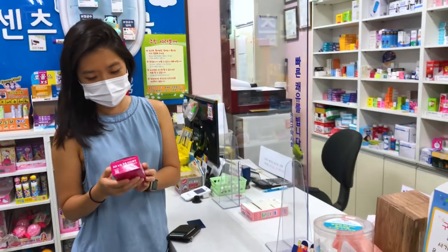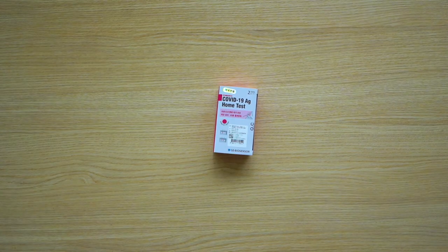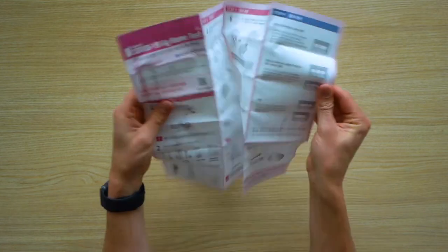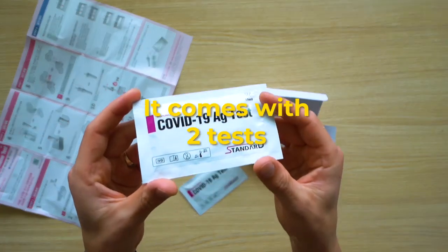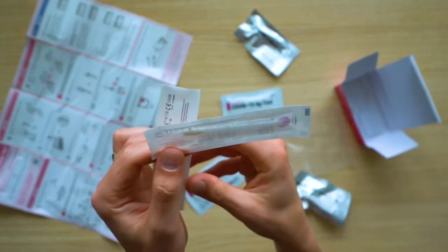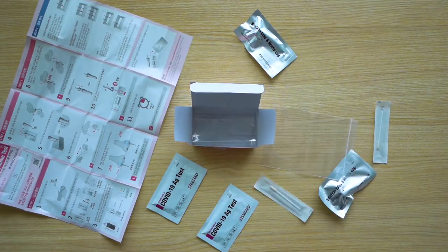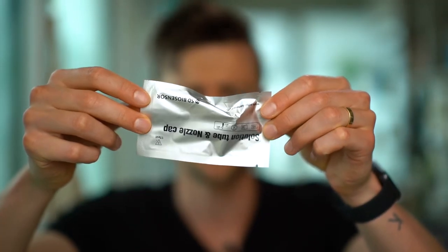Do you think it's gonna work? I mean, if it's negative it doesn't work. Anyways, I'm gonna test it out. First of all, let's see what's inside it. First thing: solution, nozzle cap.